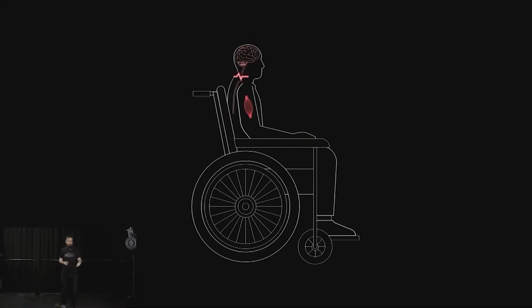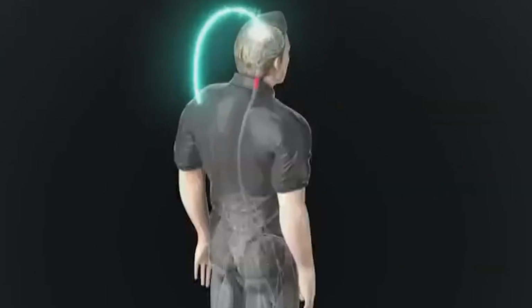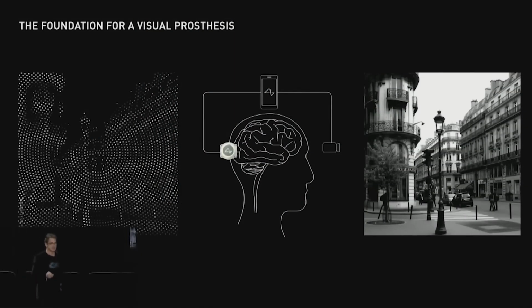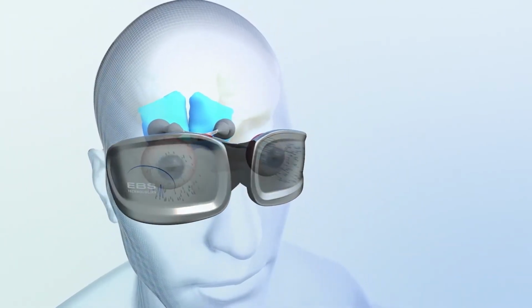Second, restoring vision, treating paralysis and certain other conditions. Paralysis is basically nerve damage. The brain sends the signal, but the damaged nerves, a kind of bridge between muscles and brain, don't deliver it. Neuralink often says that physically nothing prevents curing paralysis. No barrier says it's impossible. You can bypass the damaged bridge and send brain signals directly to muscles. How to do this if nerves are damaged?